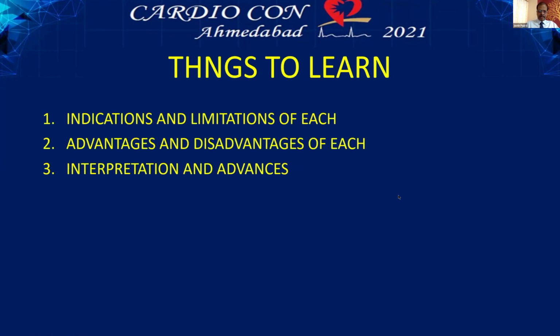And in CKD patients, unless we are very talented like Dr. Mahesh to pick and choose which to get good images with the saline, we probably can go by the side of IVUS. And in case of very larger vessels, when we really have doubts. The time is up. Yeah, fine.